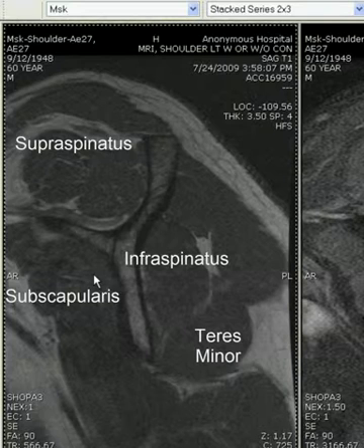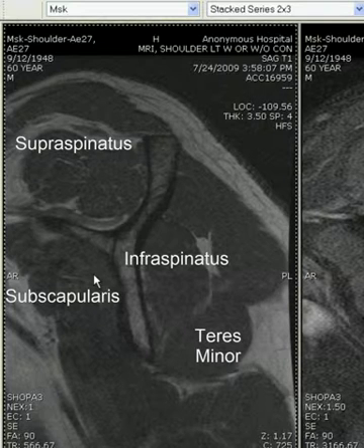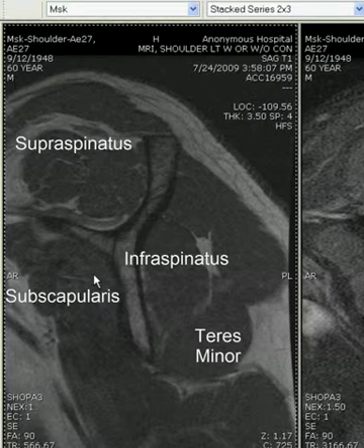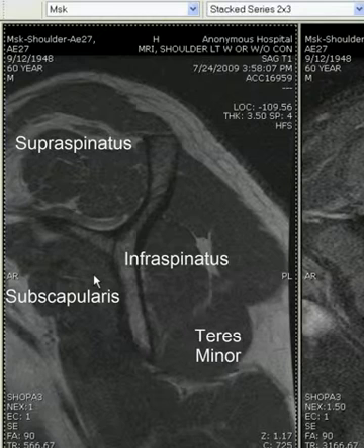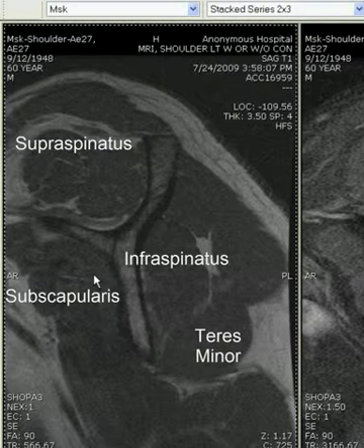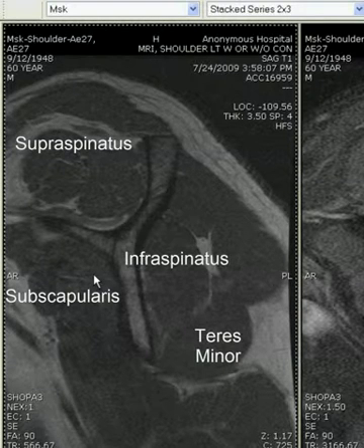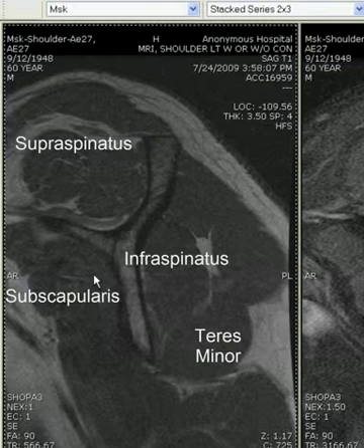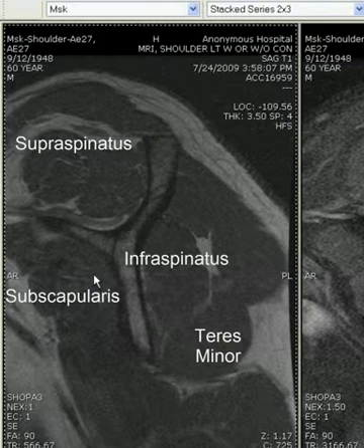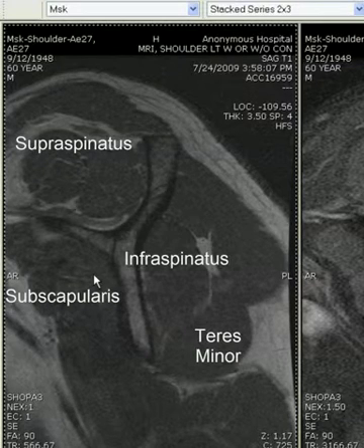So in this patient, we have a small, full thickness, one to two centimeter tear in the anterior portion of the supraspinatus tendon, with the remainder of the rotator cuff appearing intact, and there is mild to moderate degenerative changes in the acromioclavicular joint.